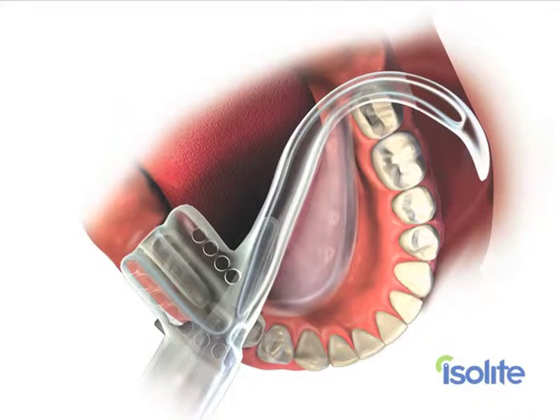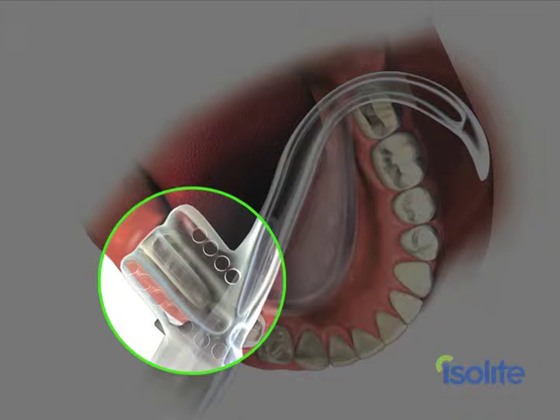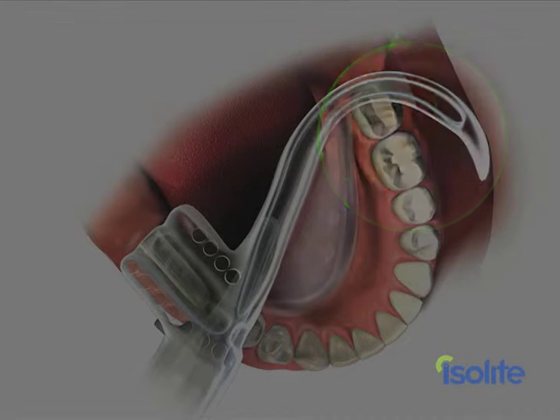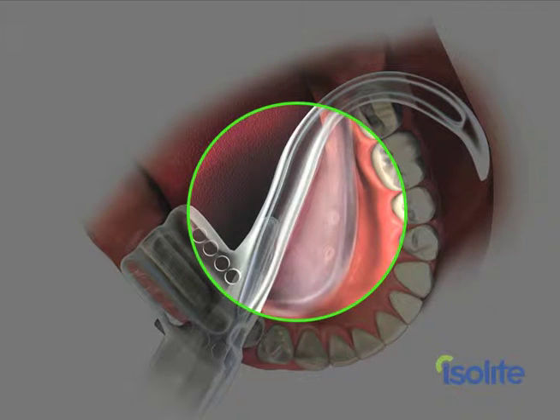Here's how the mouthpiece is ideally positioned in the mouth. The bite block is just distal to the mandibular cuspid. The cheek shield is tucked into the buccal vestibule. The isthmus is behind the maxillary tuberosity resting on the retromolar pad. The tongue retractor is tucked into the lingual vestibule with the tongue safely positioned behind it.